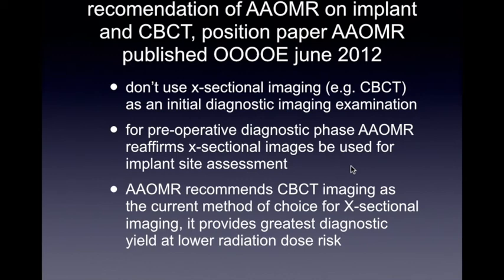And therefore, way back in 2012, they already pronounced that CBCT is not an ideal imaging modality as an initial diagnostic imaging, except for implant site assessment.